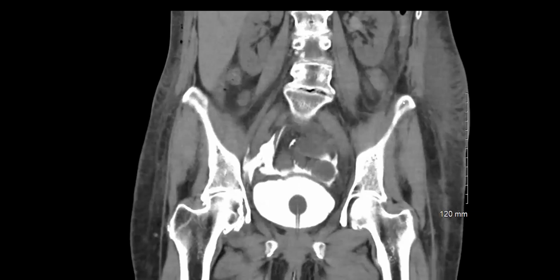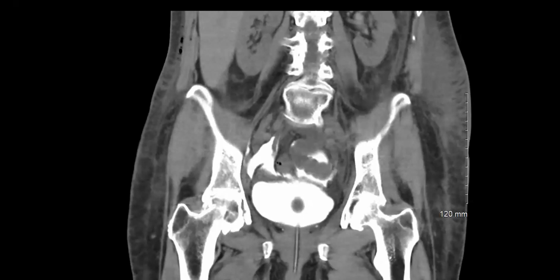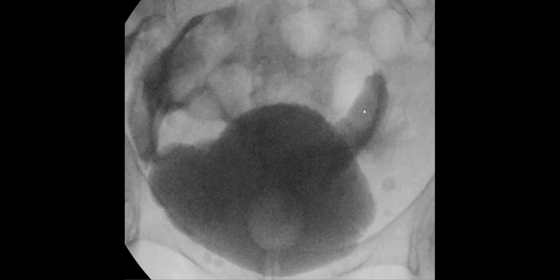But what I had forgotten was there are 5 types of bladder injuries, apparently. One is a contusion, where the VCUG would be normal. Two is an intraperitoneal rupture. Three is interstitial, a very rare kind of injury. Four is extraperitoneal, and five is a combined intra- and extraperitoneal. I've never used this classification. We always look for intra- or extraperitoneal rupture because intra, you want to send them to surgery, whereas extra is treated conservatively. So I just thought, let's go back to the basics for this.